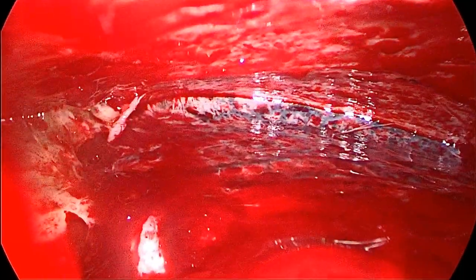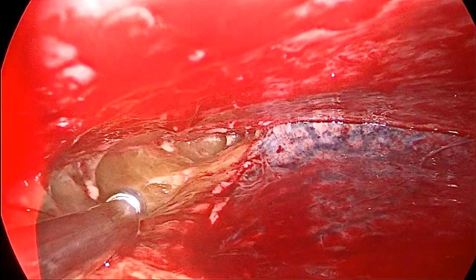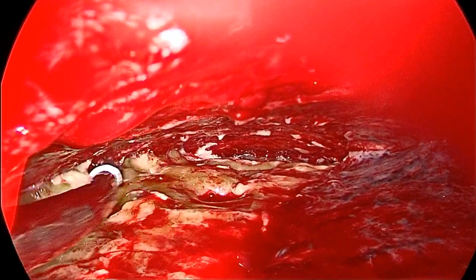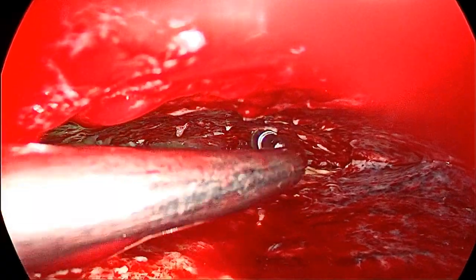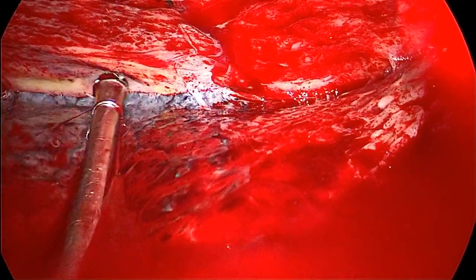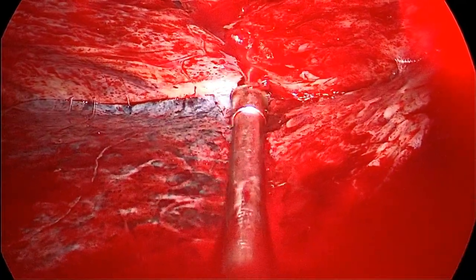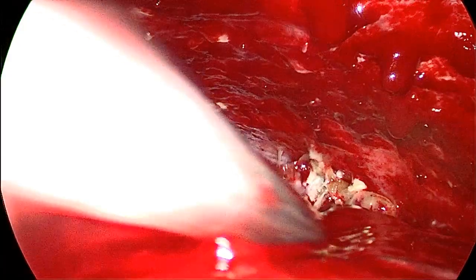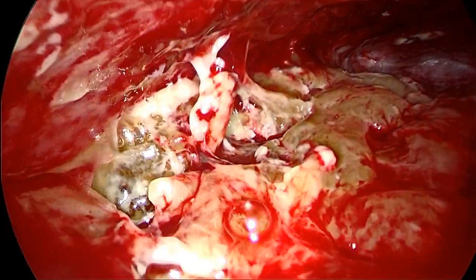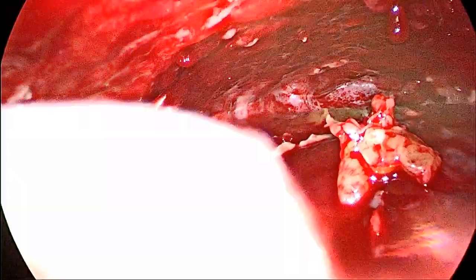We try to push the lung down to get more space to work in. We point the scope caudally to see the largest pouch, which is a sub-pulmonary one. As the patient is toxic and in the acute phase, you can see the bleeding, inflamed surfaces all over. The empyema is organized mostly due to late presentation, as the patient was afraid to come for hospitalization.